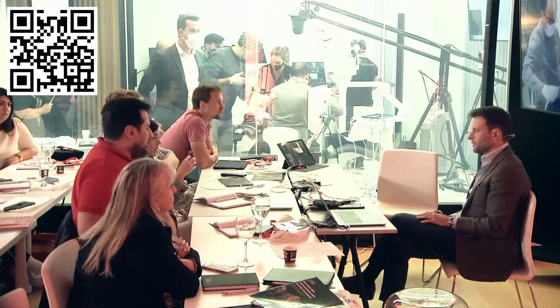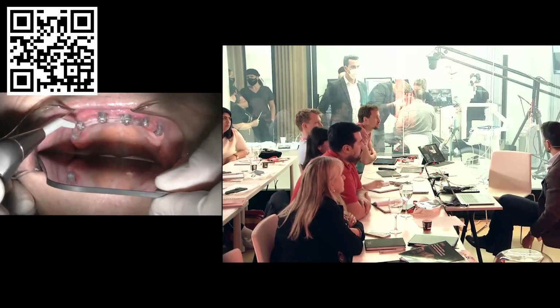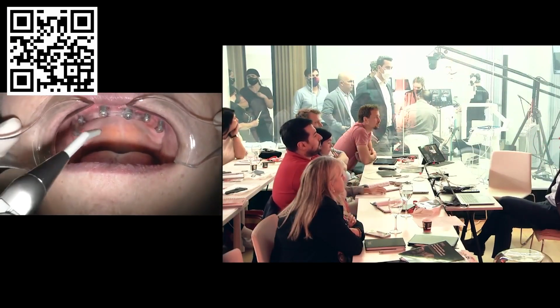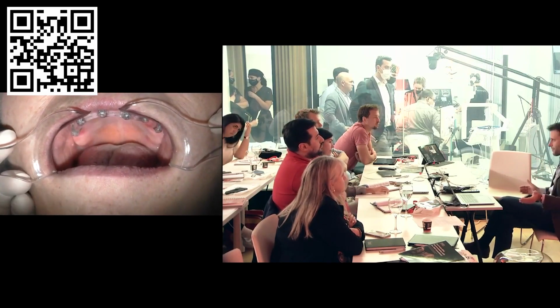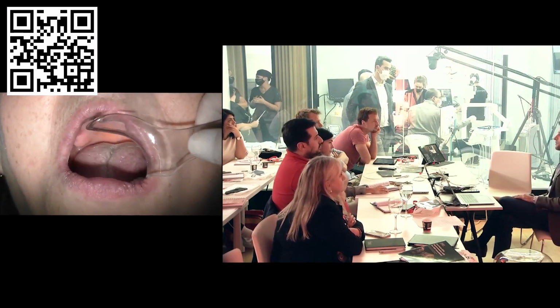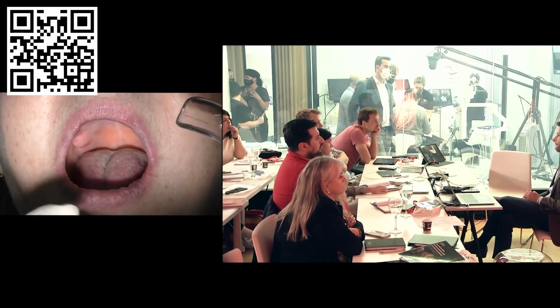When the prototype comes, you use it to make sure of the result. This prototype should come already with the modifications that you did on the immediate loading. But if you miss something, you have less chance to fix it here.